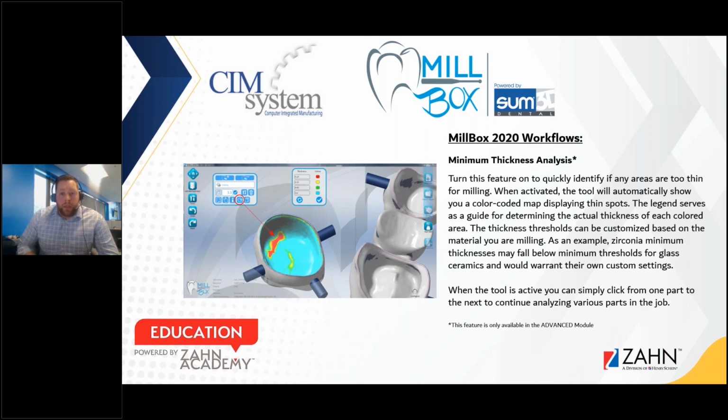in their milling debuts. Normally we would have such safeguards in the milling or in the CAD software that allow us to enforce minimum thickness and see instances where there are minimum thickness problems, and we can adjust it there. But there's never been such a safeguard on the milling end to prevent any sort of third-party design from coming into our milling software without being able to enforce those thicknesses or see where there might be problems in those areas.